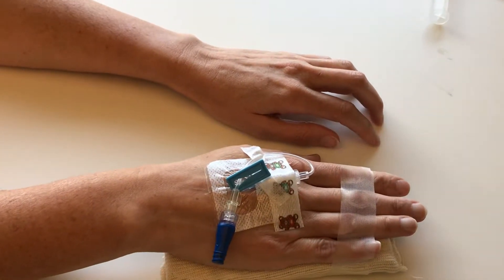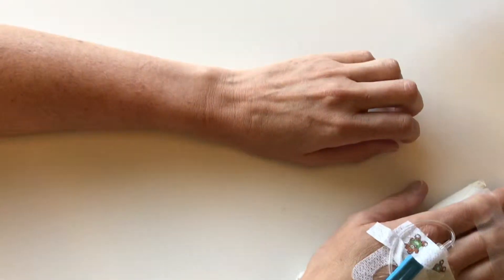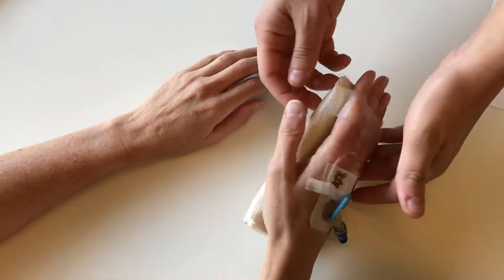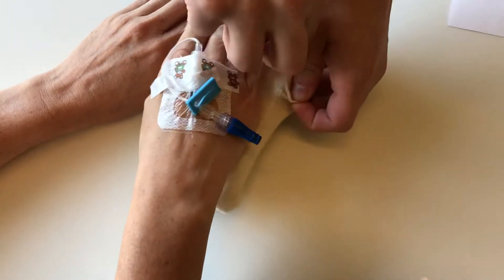When we're assessing the site, we want to compare one side to the other. You want to take your insertion site and compare it against a hand that's normal. In order to do that, you're really going to have to break down the entire site almost and take away the board to compare.